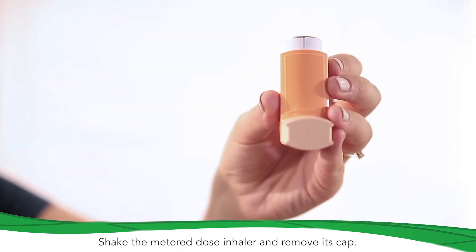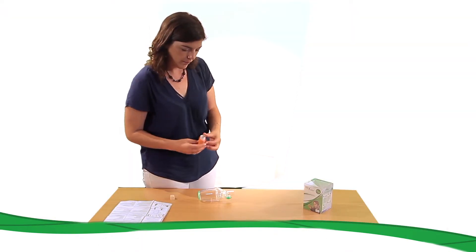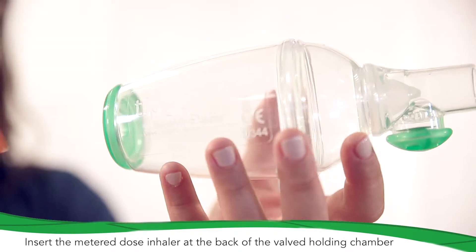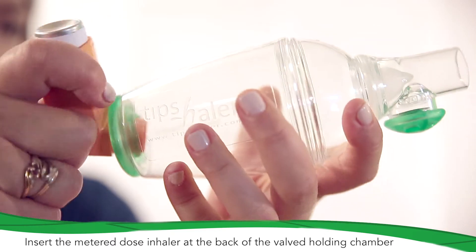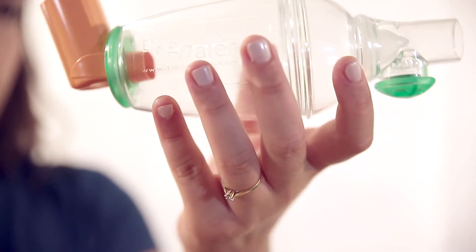Shake the metered dose inhaler, then remove its cap. Insert the metered dose inhaler in the flexible connector at the back of the valve holding chamber. Thanks to its flexible material, Tipshaler fits any metered dose inhaler.